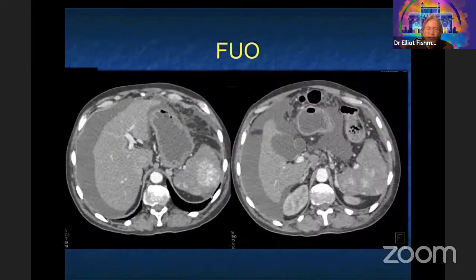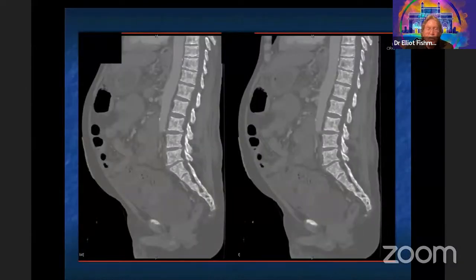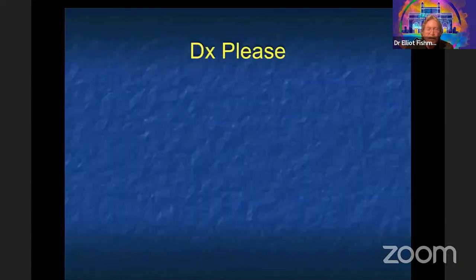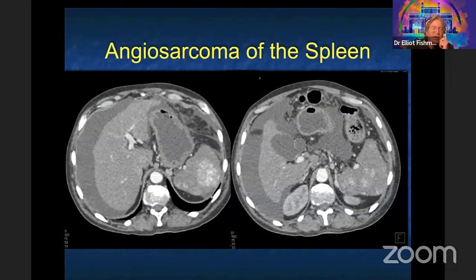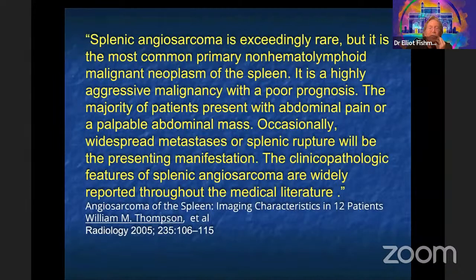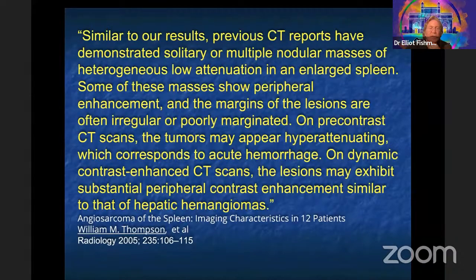You can see sclerotic bone lesions, then a vascular lesion in the spleen. Hemangiomas can be vascular, but this is diffusely vascular — you have ascites and widespread blastic bone lesions. Someone suggested angiosarcoma — very good. We've had three cases of angiosarcoma in the last four or five months; they're exceedingly rare. They can cause splenic rupture. The lesions may exhibit substantial enhancement. Hemangiomas are better defined.